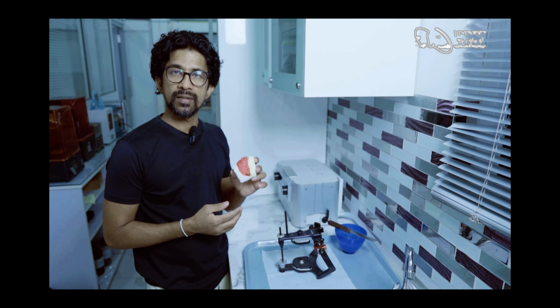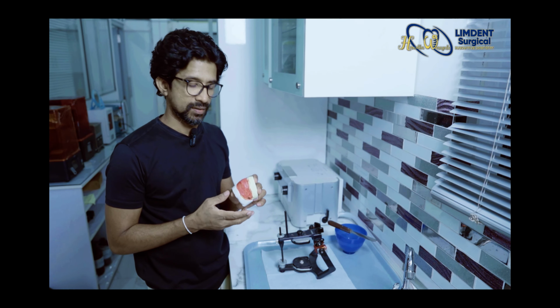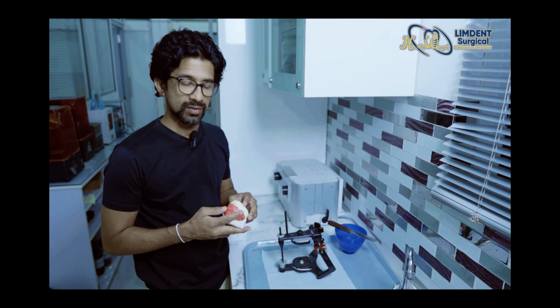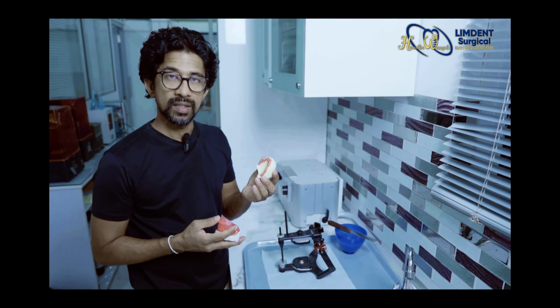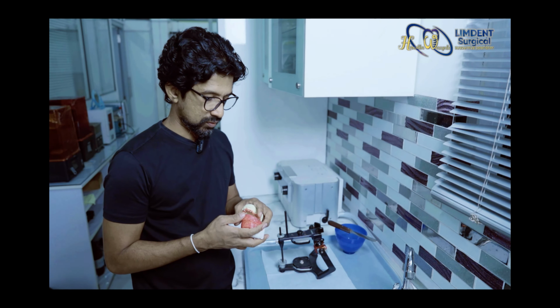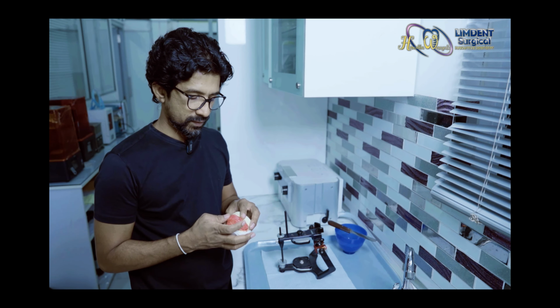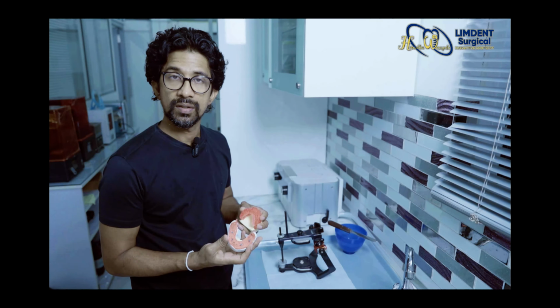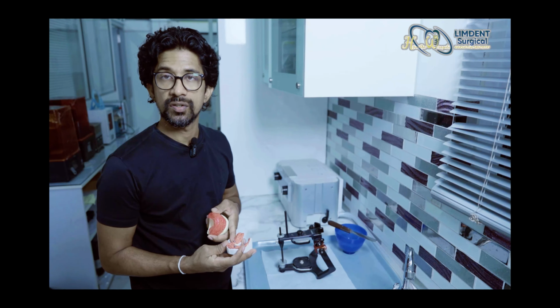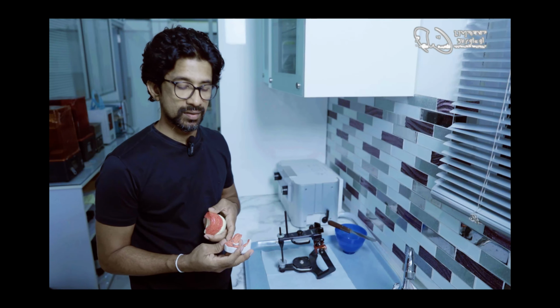This is the bite registration of an all-on-X implant case, the full mouth reconstruction. So you can see that once we get the final impression, the cast will be made. So the bite registrations that we have done previously, this is the lower cast with the final implant positions and the soft tissue recording, and the details have been made on this.